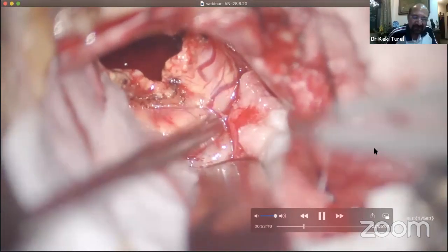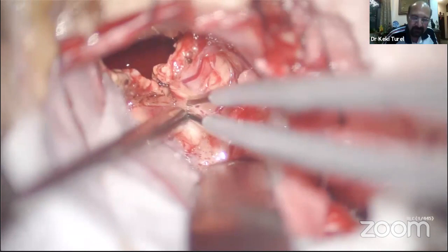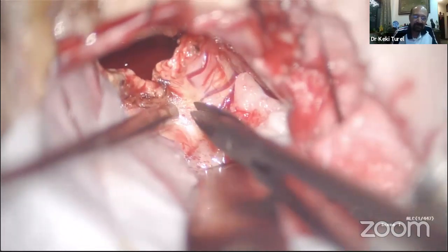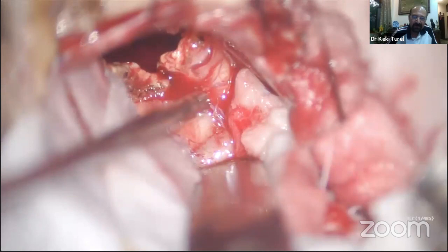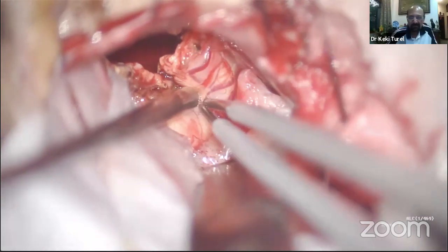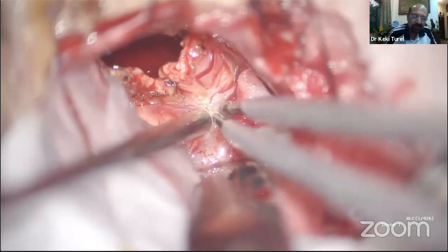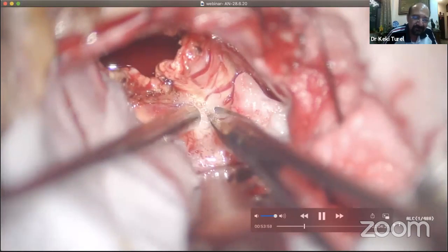My comment was the same, as you mentioned very early on, that you do not use a coagulator, not only for the surface arachnoid, but even for the tumor surgery. Every time you coagulate a tumor, you stop the bleeding, and then you bite or cut it, and again it bleeds. So it's a waste of time. Unless you come across a big bleeder, you don't stop all these small bleeding points; instead allow your assistant to irrigate and suck so that your two hands are busy working on the tumor. That way you can go on with the job a little quicker. Correct.